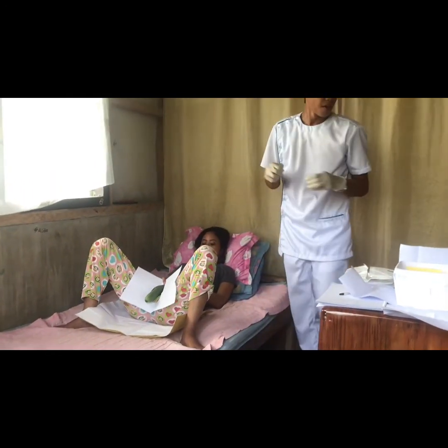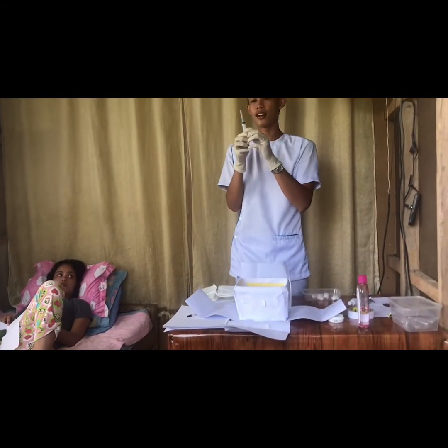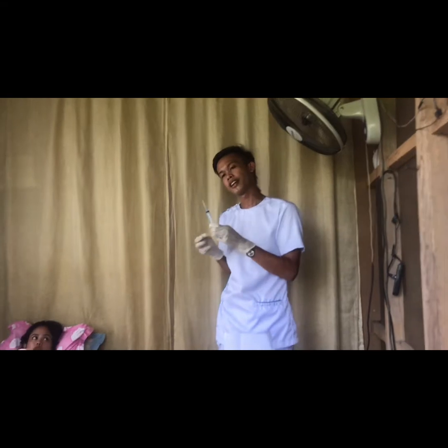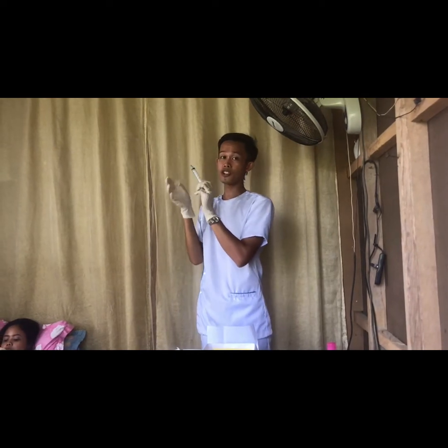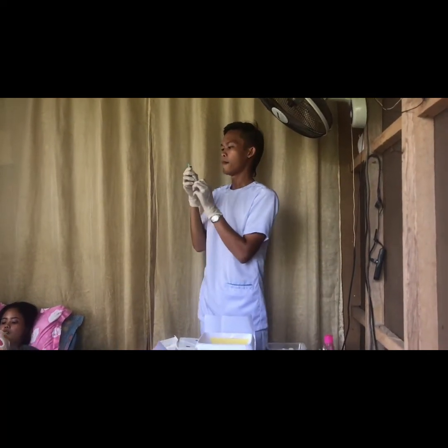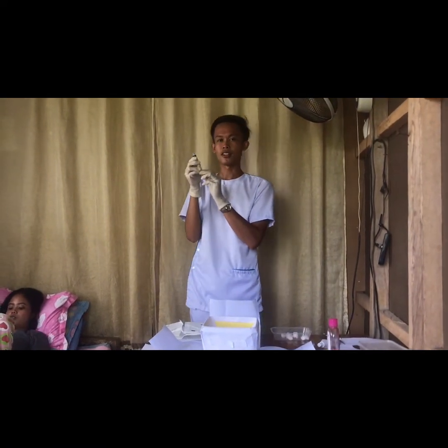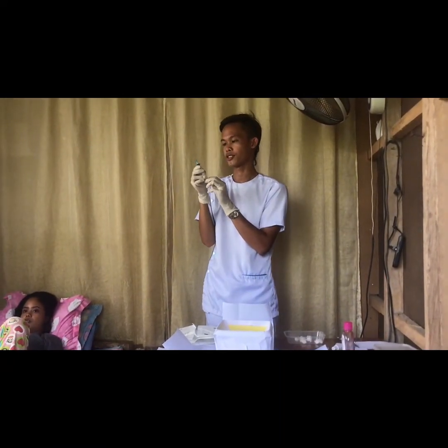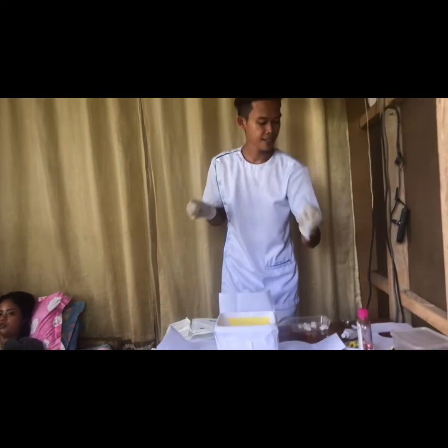Okay, so for this time, I'm going to take the 10 cc syringe itself. The 10 cc syringe contains distilled water. I'm going to open it, and push it back in order to break the tip of the syringe. And then we're going to set it aside.